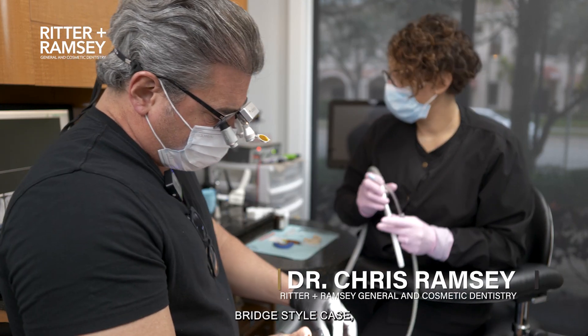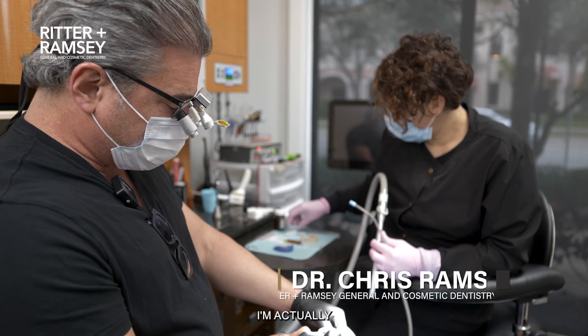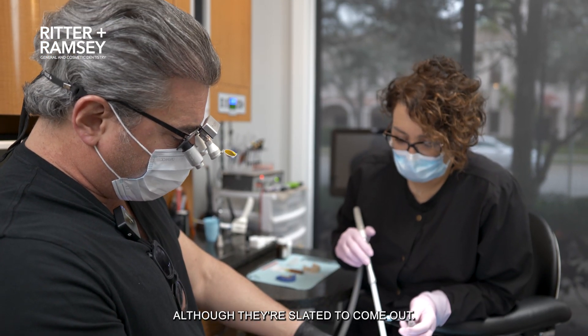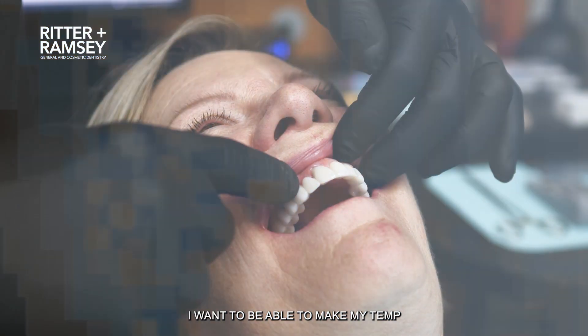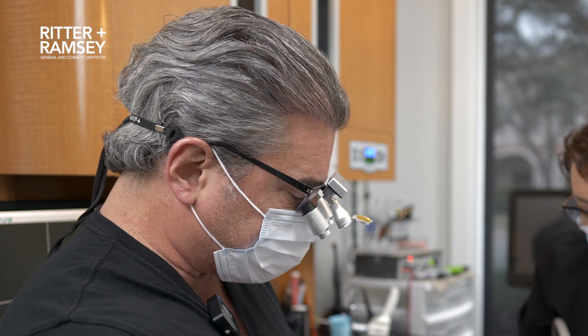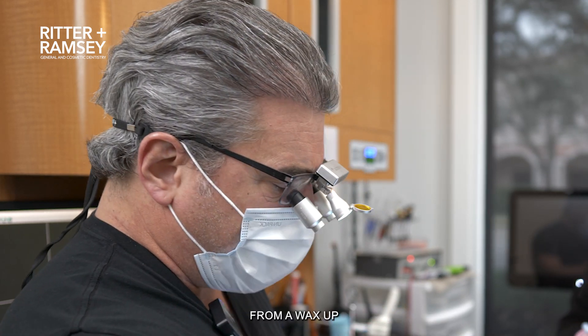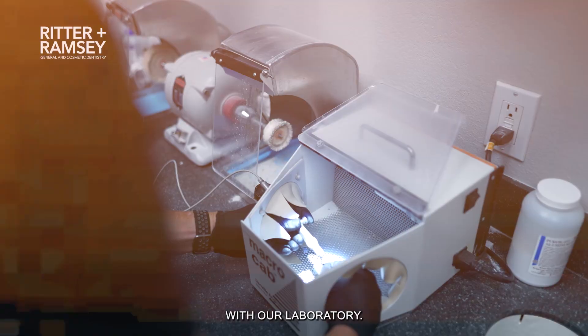Anytime we're doing a bridge style case, this is going to be a scenario where we're going from 22 to 27. I'm actually just prepping these lower teeth, although they're slated to come out. I just want to be able to make my temp over that, and then we're going to still take out 23, 24, 25, and 26. I will make a temporary from a wax-up that we've already done with our laboratory.